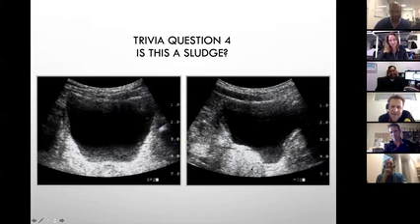EJ, would you want to scan through the bladder? Can you be clear? Yeah, as in going off axis, scanning through the bladder with multiple different views. Would that help? Would definitely help. If you go out of the traditional views and go oblique, you might avoid the slice thickness problems. I totally take your point. Anything easier than that?